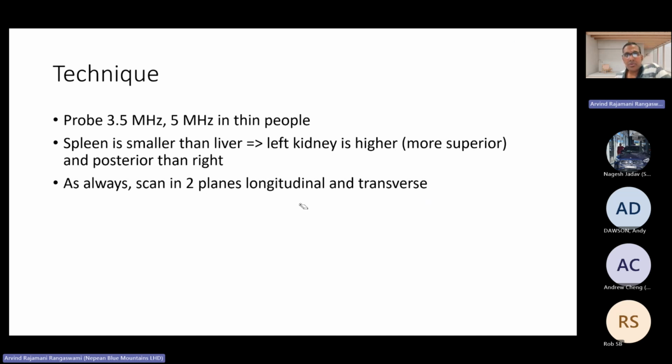You take an abdominal probe, typically 3.5 megahertz or so. You want something with a slightly deeper penetration because the kidney is a deep-seated structure. Okay. I've already told you that in any ultrasound, you start by getting one structure that you can recognize, and then add an additional structure that you can recognize in order to get the anatomy.